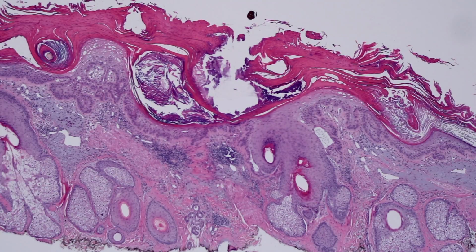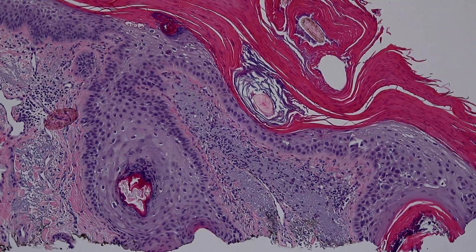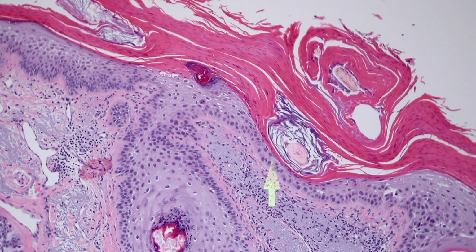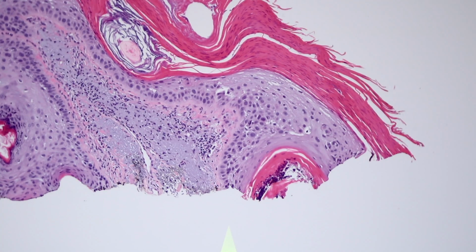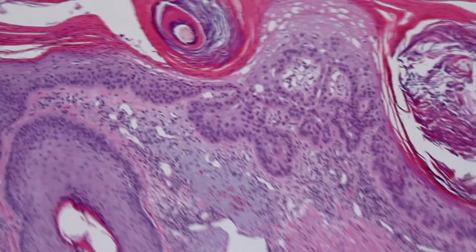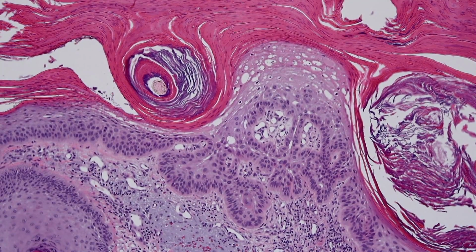Here's another example of actinic keratosis. And the reason I want to show this one is because you can really nicely see how it extends down hair follicles. So you can see the actinic keratosis here. These atypical cells are just coming in and they're running straight down the edges of the follicle. They don't fill the whole thing up usually. They just kind of bulge down the edge, and the center of the follicle is still there. So this can be problematic, especially when you get, oh, here's some more over here. These kind of budding of the rete.